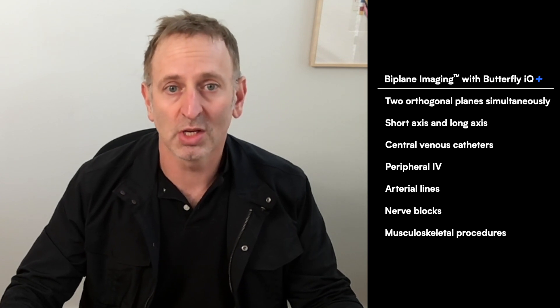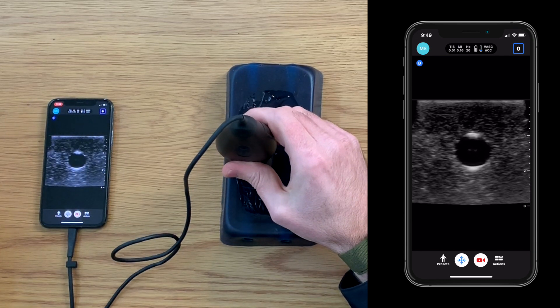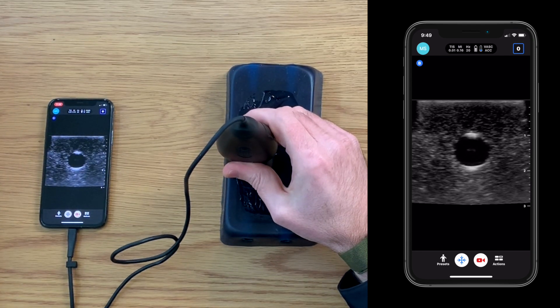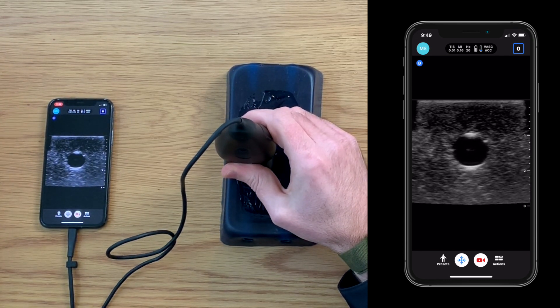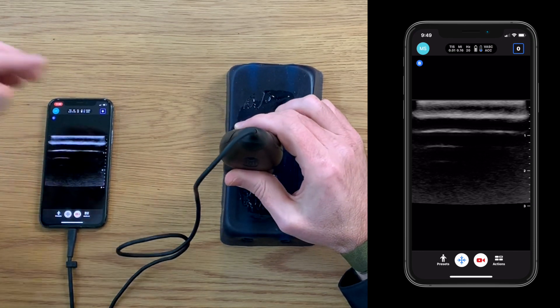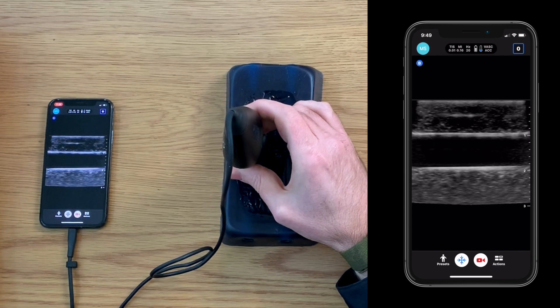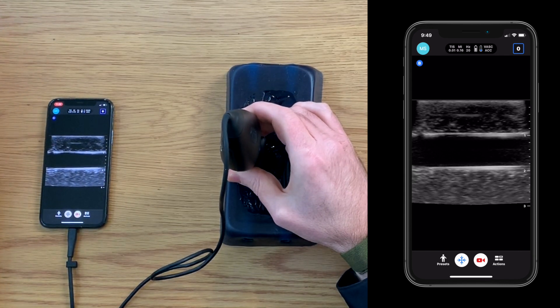In traditional imaging, we're in B-mode or 2D and we're used to getting a two-dimensional slice of a structure and seeing it just in that plane. So if I take the IQ+ and put it onto this tissue phantom, we can see a simulated vessel in a short axis plane. If I want to look at it in a long axis, I need to take off the probe, rotate it 90 degrees, and place it back down to obtain a longitudinal image of the same structure.